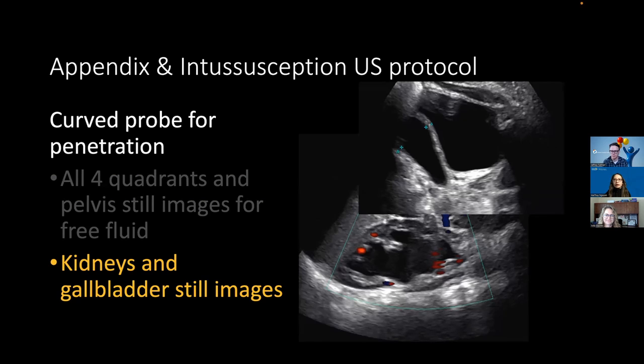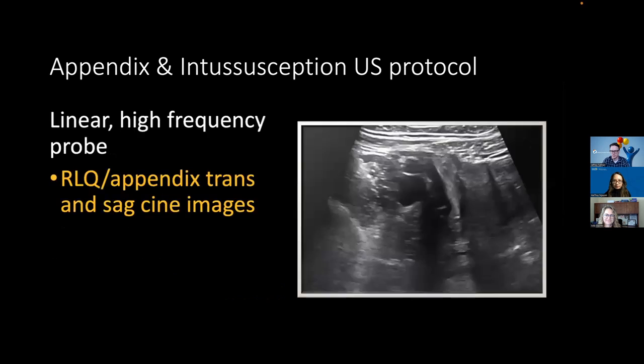And I know when I worked at Texas Children's, we actually stopped screening. So we basically just went straight to, if it's an appendix ultrasound, we just look for the appendix. But I think here, because the patient population might be different, in that there's a lot of Medicaid type patients, essentially this might be the first imaging they have, and maybe ever have. So I have shifted my point of view to, we should screen just in case, so we do catch something that could potentially change a lot of management for these patients who otherwise don't have the routine care.